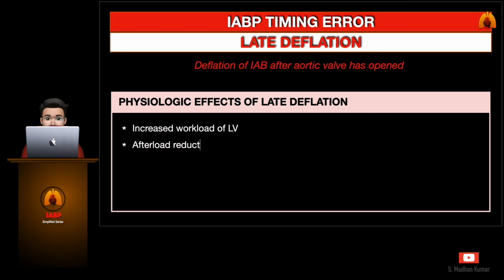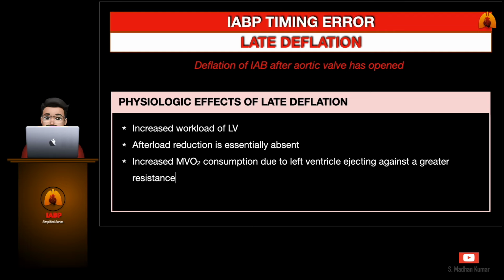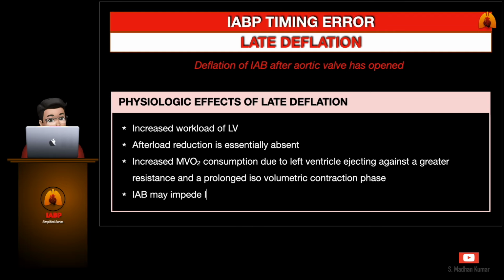The physiologic effects of late deflation are increased workload of left ventricle, afterload reduction is essentially absent, increased myocardial oxygen consumption due to left ventricle ejecting against a greater resistance and a prolonged isovolumetric contraction phase. Intra-aortic balloon may impede left ventricular ejection and increase the afterload.